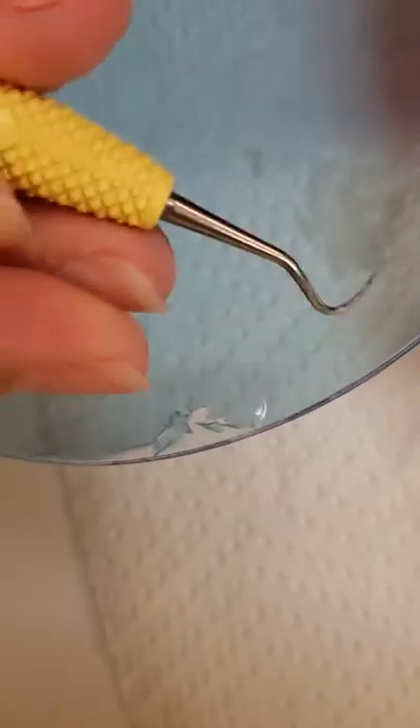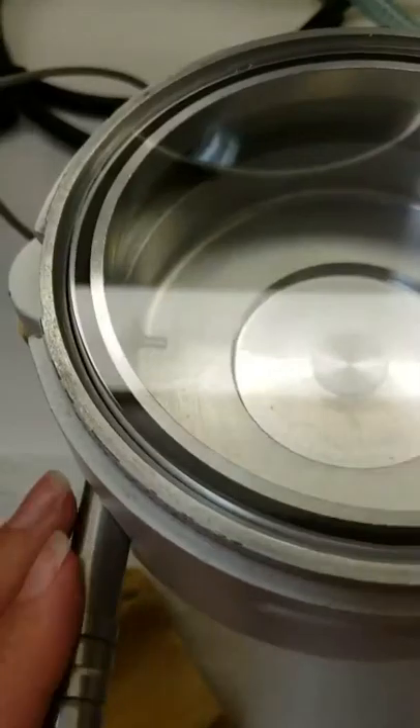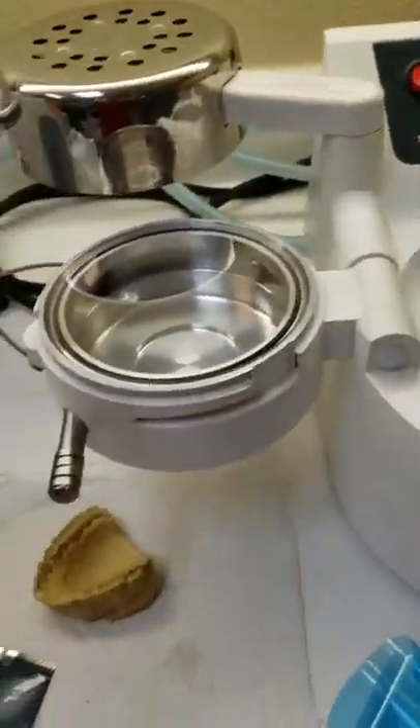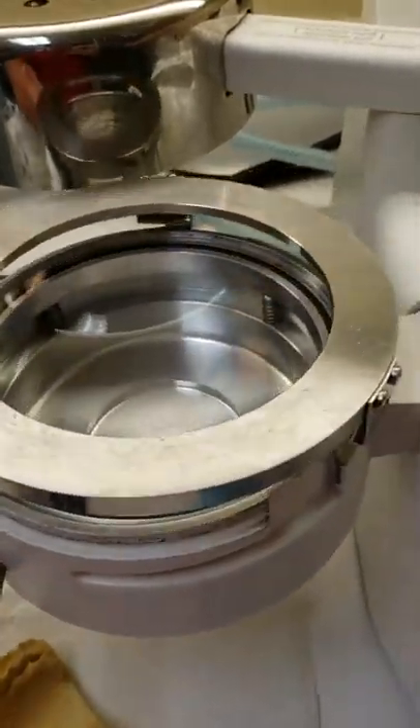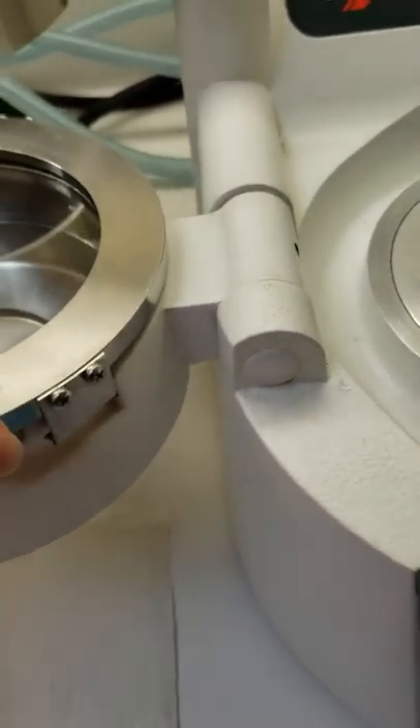Now it's transparent — you can see right through it. Go ahead and load it into the reservoir; it lines up just perfectly and goes right in there. Then the little lock plate goes on top, lining up in the grooves.